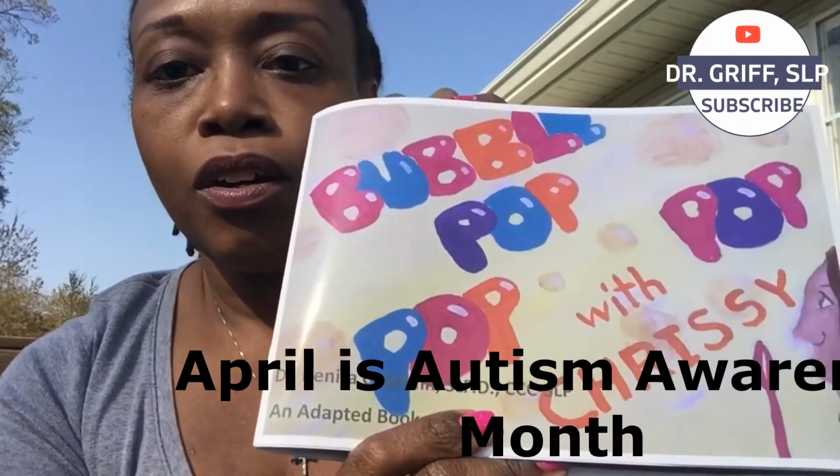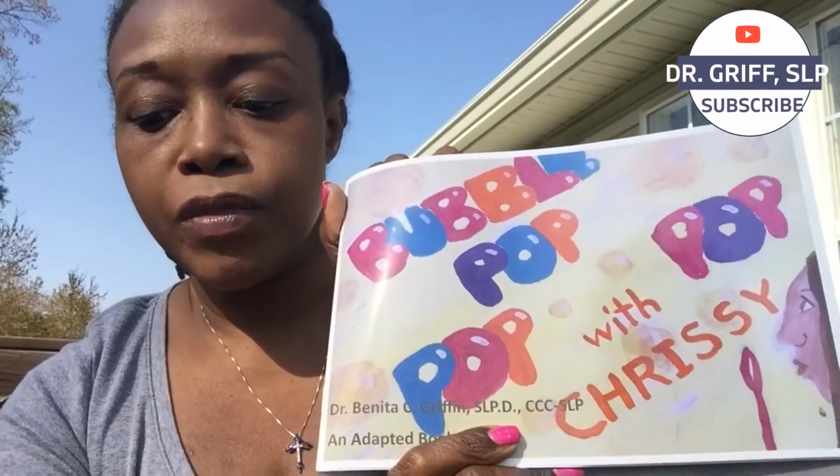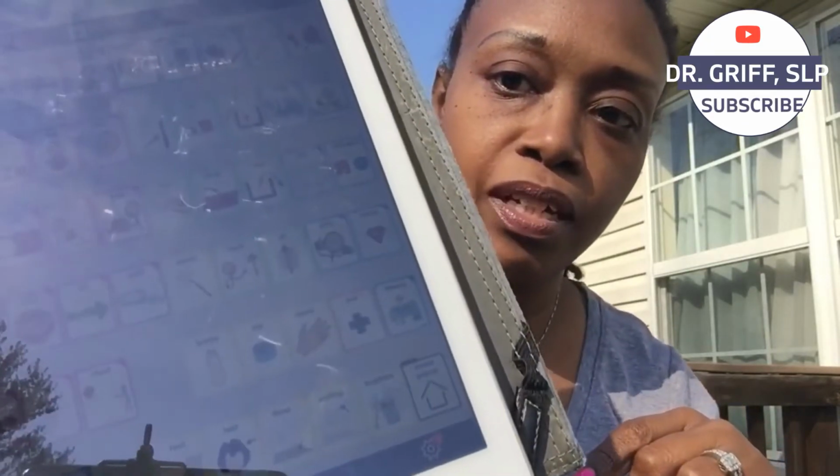April is Autism Awareness Month, and with a lot of the students that I've worked with who do have autism, some have needed AAC as well. And if you've watched my other videos, you know that AAC is my professional area of focus. And this book is an adapted book, so it is adapted with picture symbols that can accompany the story. And I also have with me my iPad with Proloquo2Go today. And we'll see if we can use this with aided language stimulation today during our activity or during the book. We'll see how it goes.